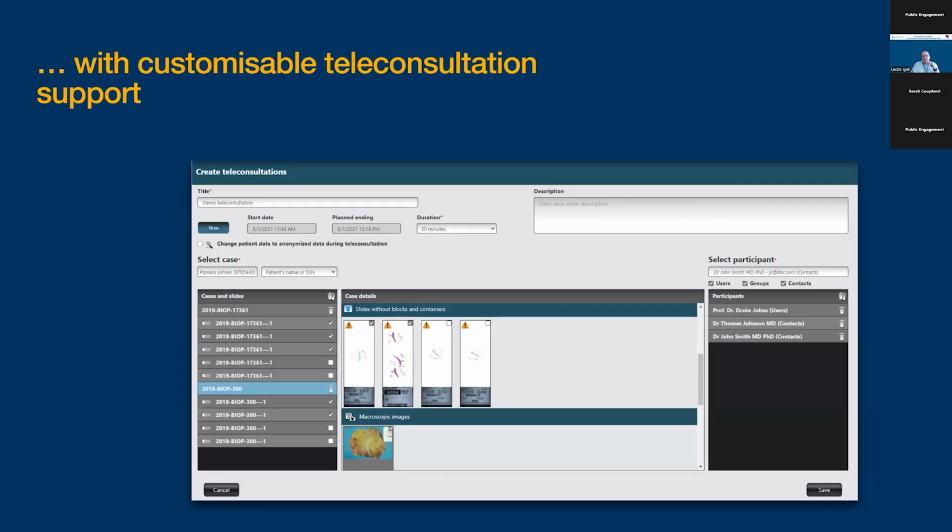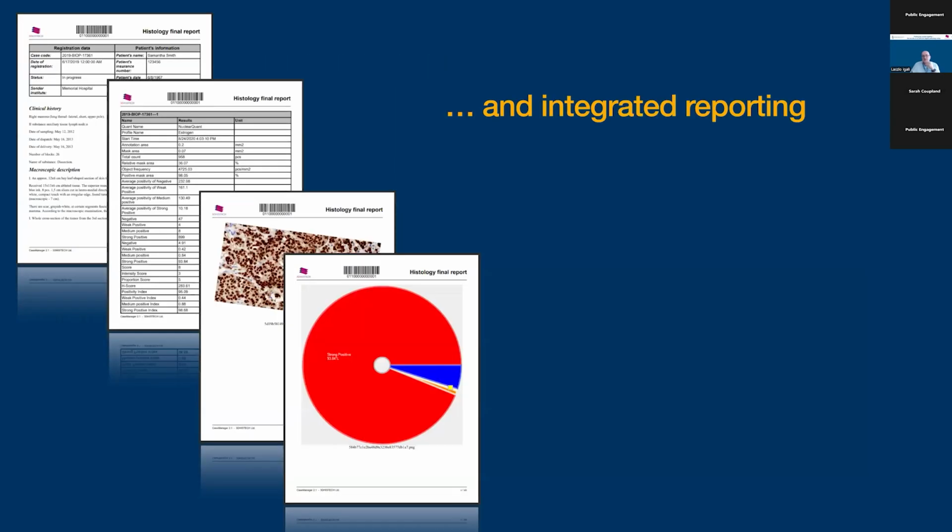One important element for teleconsultation, which many people overlook, is: is your digital pathology system able to teleconsult with somebody outside your system? Many of the systems only allow you to consult with people who can log into your system. And if you've got a closed system with VPN connection and specialized computers, good luck with it. It needs to be done through HTTPS, cloud-based, or essentially external consultation.